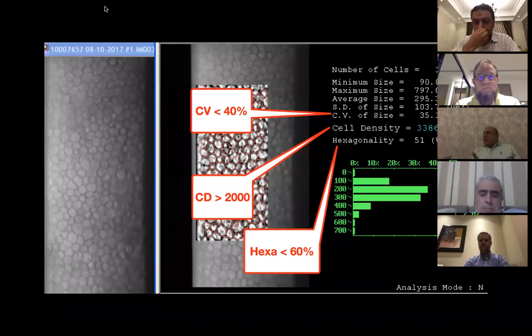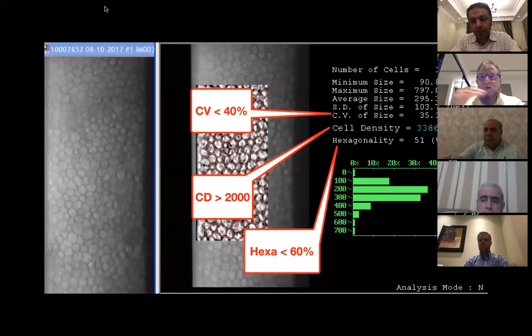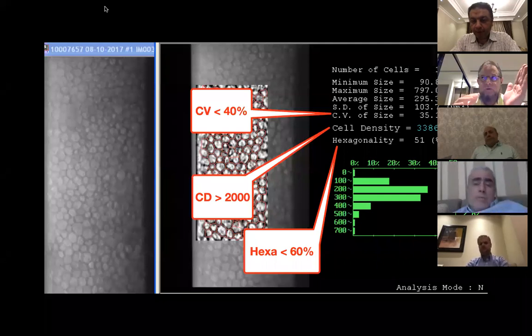But I think in most of the chamber phakic IOL, there is no significant effect on endothelium. What I know is that the phakic IOL makes a loss of 2%, so it increases three-fold the age-related loss. As Dr. Majdi said, it is 0.6% per year without phakic IOL. But with phakic IOL, as far as I know, it comes to 2%. I think it's more for Mazen. Loss. I think it's more than 2%.